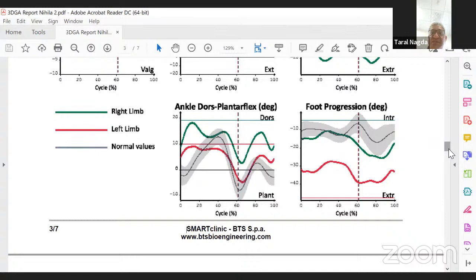Right. Okay, and then how do we look at this ankle kinematics? Yeah, I think this shows hyper dorsiflexion, especially there on the right side. But I think what we're seeing is what was mentioned before. This is likely measuring our midfoot break. This is a single segment foot model that really can't distinguish between midfoot break and true dorsiflexion. So that is a pitfall of looking at these plots without recognizing that.